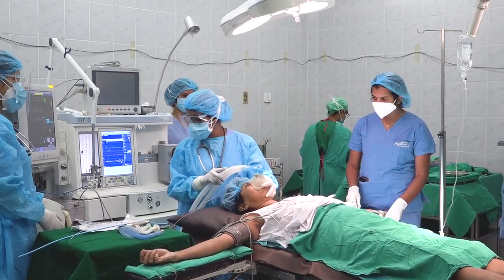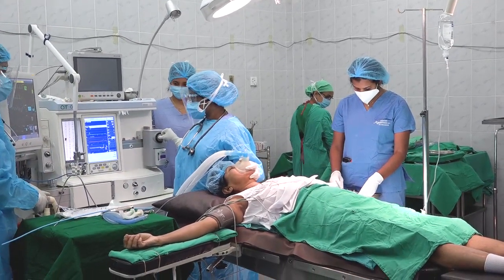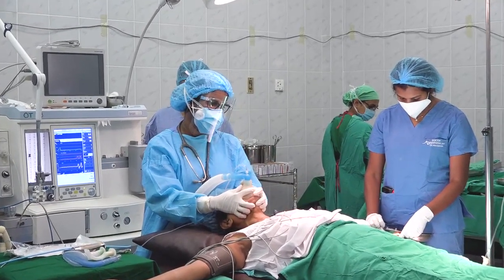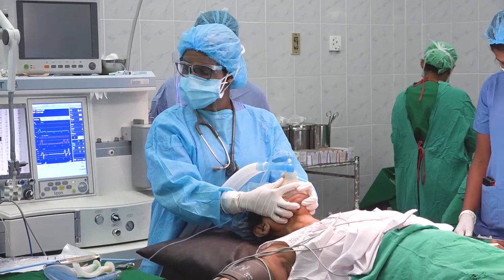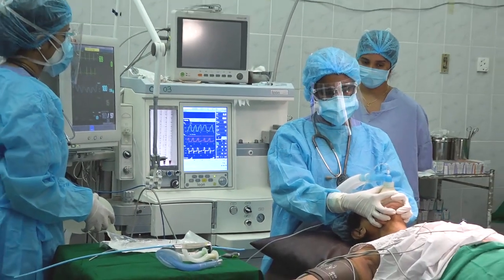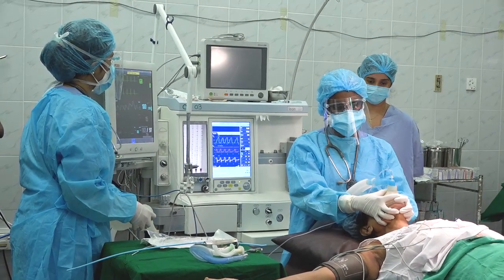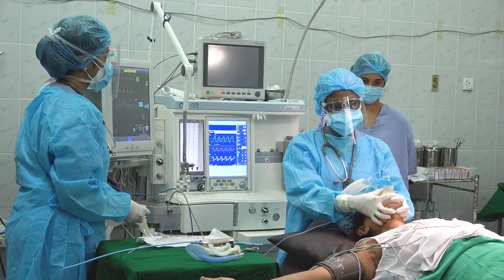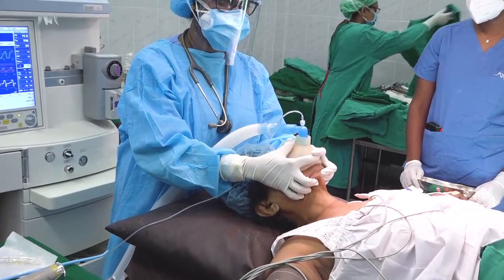After administering the intravenous anesthetic solution and the non-depolarizing muscle relaxant, you have to ventilate the patient for about 2 to 3 minutes till the neuromuscular blocking agent starts to act. During this period, you have to ventilate the patient with 100% oxygen and about 2 times of minimal alveolar concentration of the volatile anesthetic agent, which could be isoflurane, or sevoflurane, or desflurane.